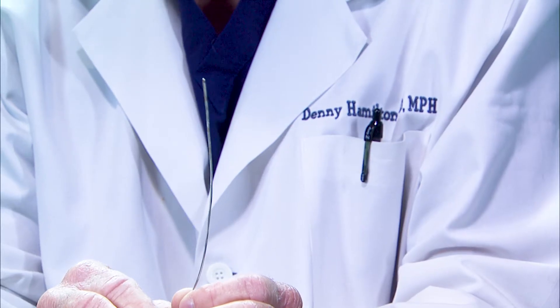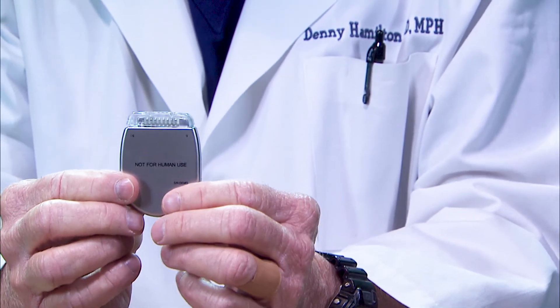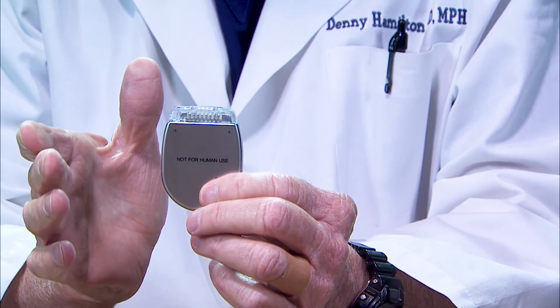Five days later, we just pull this out — kind of like a wet noodle. If half or more of your pain is controlled during that five-day period, two to three weeks later we'll put in a permanent device. This is the permanent device — it's the generator for the leads that are along your spinal cord.